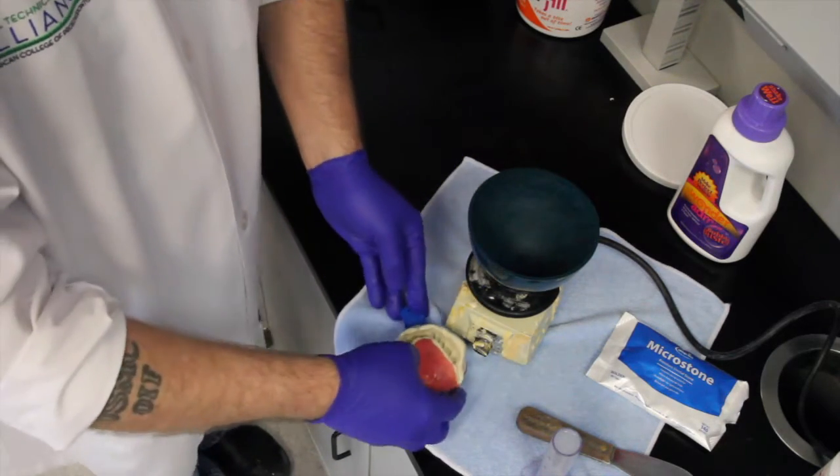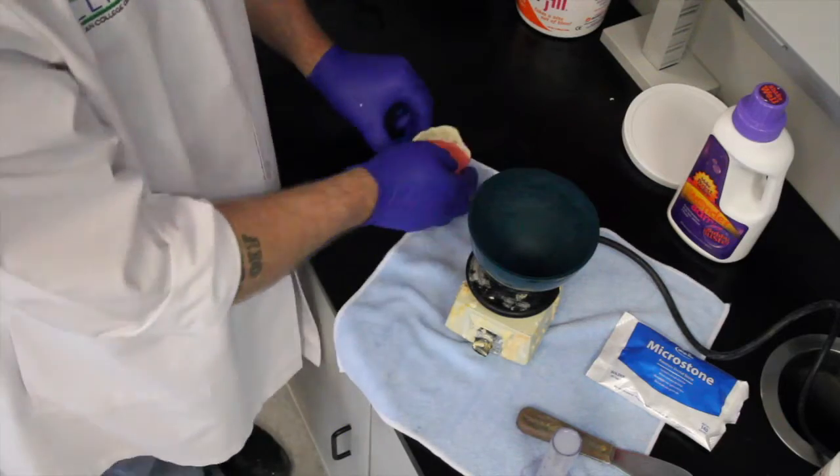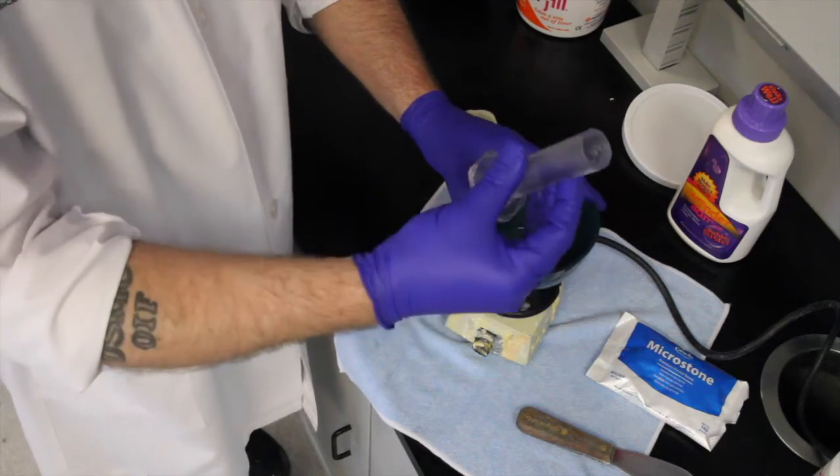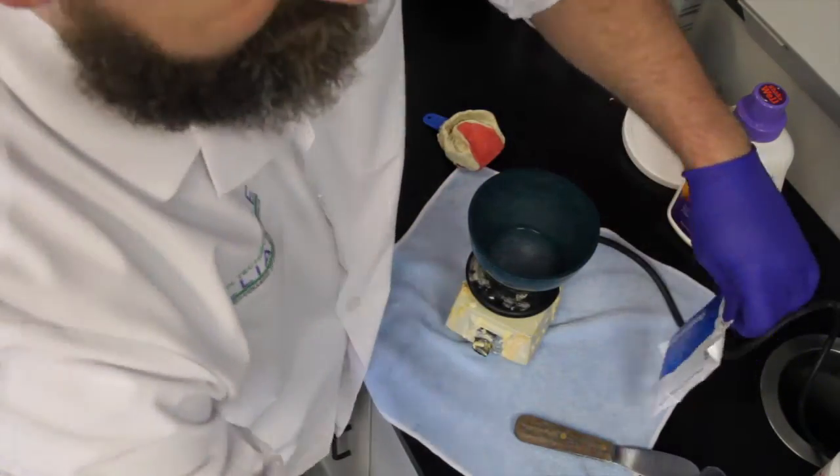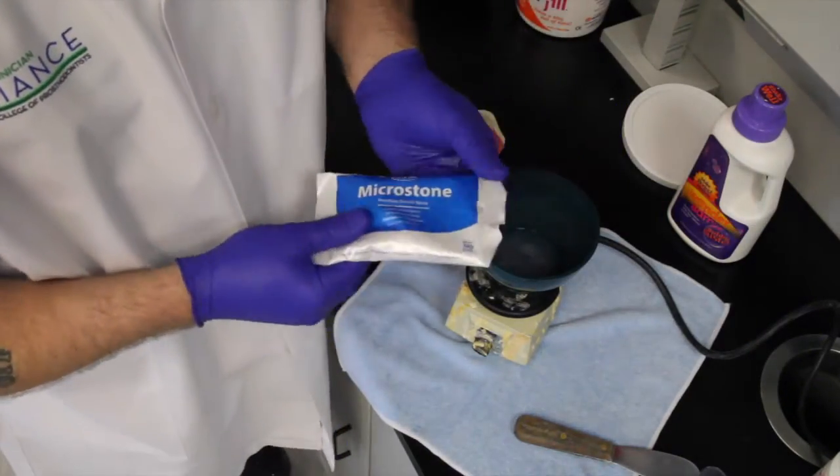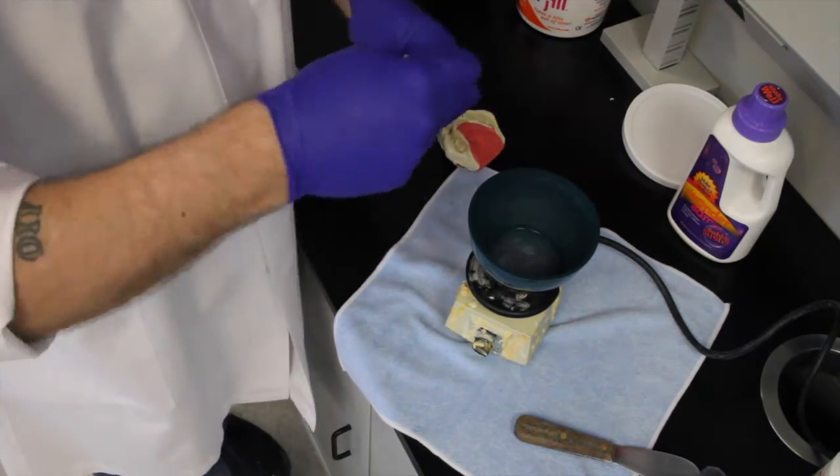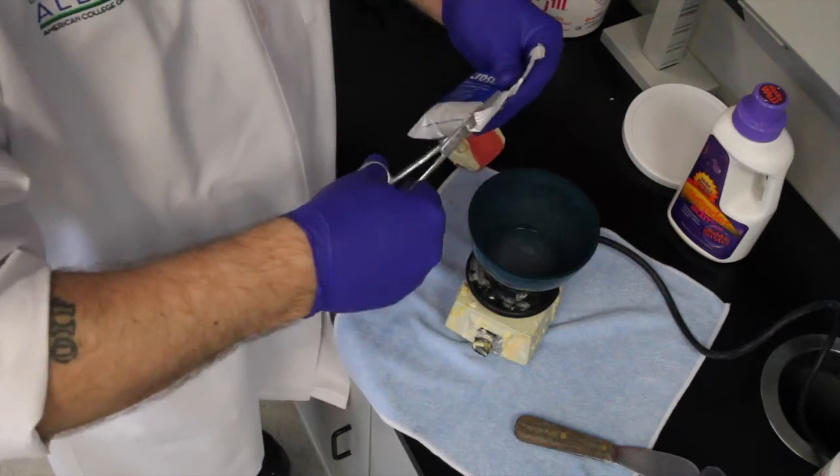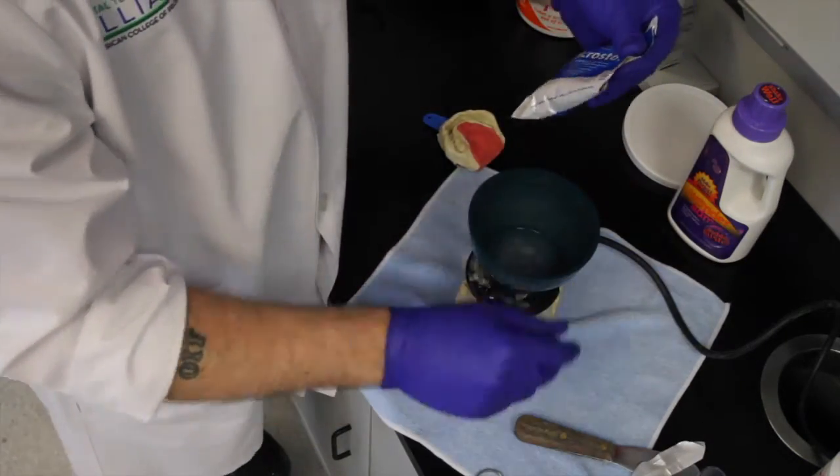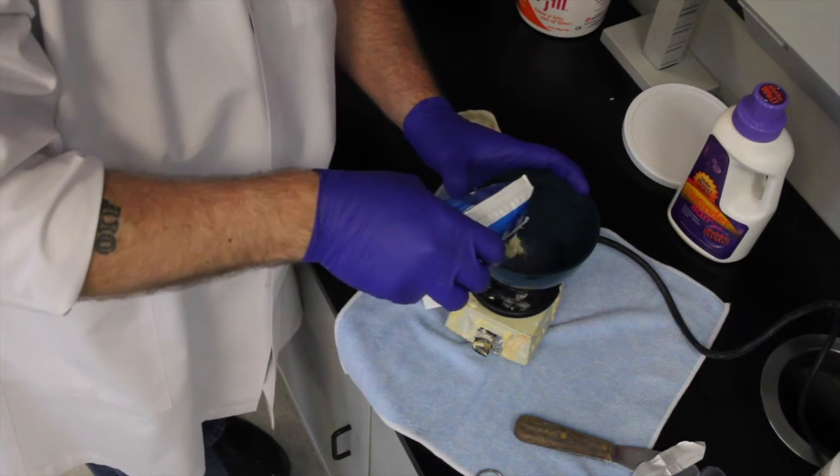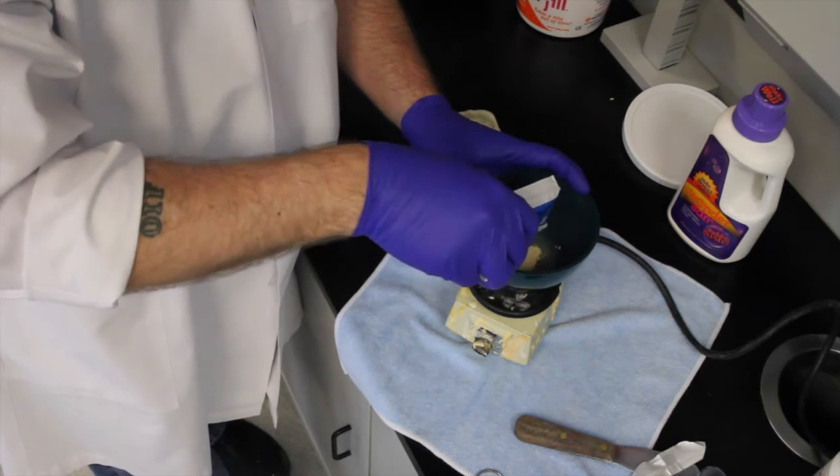So now we're going to add our admix into the bowl. 41 milliliters. And once again, we're going to be using the MicroStone from Whitmix. Shake all the powder to the bottom of the bag. All I like to do is cut the top of the bag off. And then slowly add the powder into the liquid, the admix.